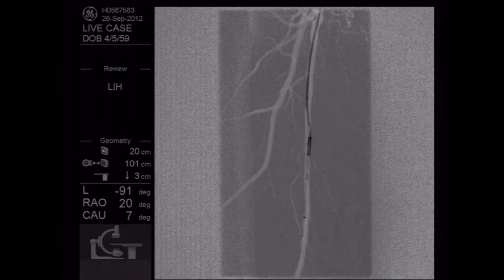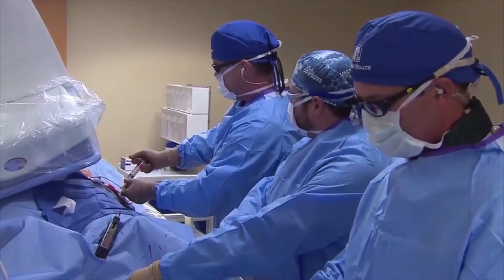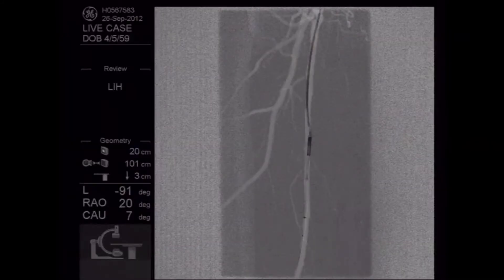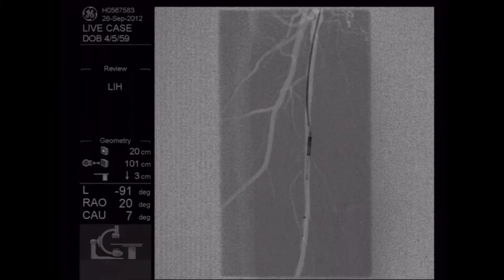Let's just do a little follow-up run right there. We're administering during the course of the procedure — prior to starting the atherectomy we did, and now we're adding a little bit of heparin, which is a blood thinner that we give intravenously or intra-arterially to keep the blood real thin so that we don't add any propensity to cause thrombosis or clotting. Injury is one of the main reasons why people develop clots in the arteries or veins, and obviously we are traumatizing the vessel, so we're very cautious to keep the blood nice and thin so that doesn't happen as a complication of our interventions.